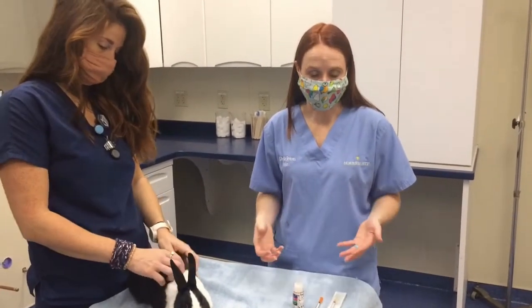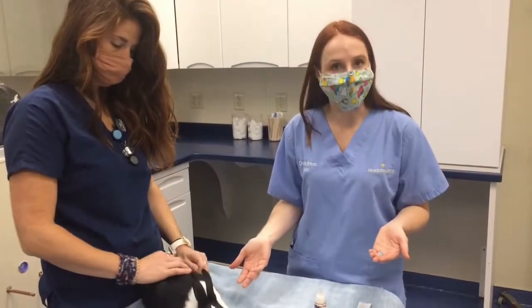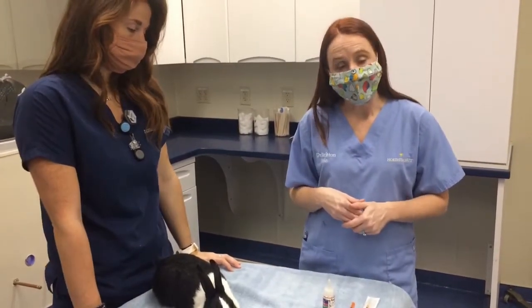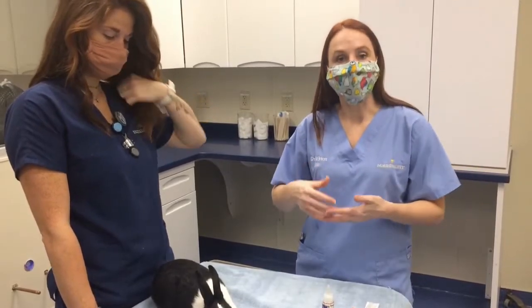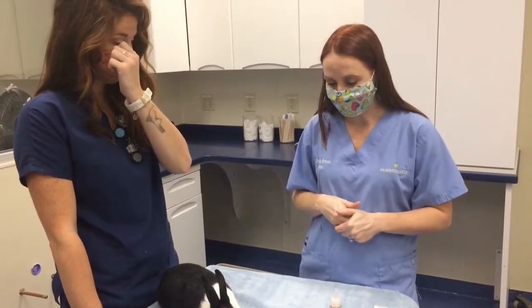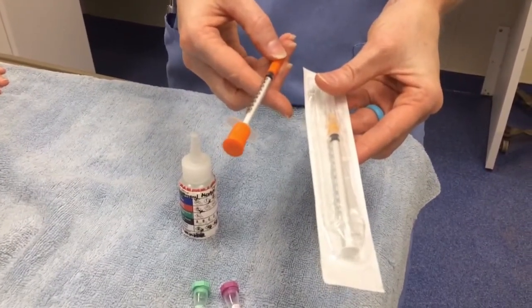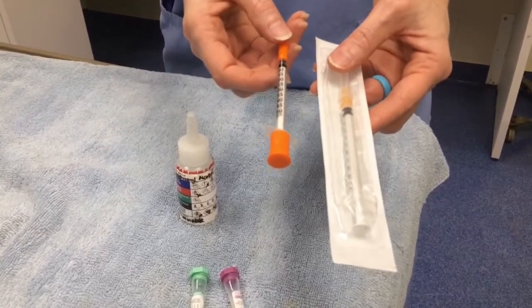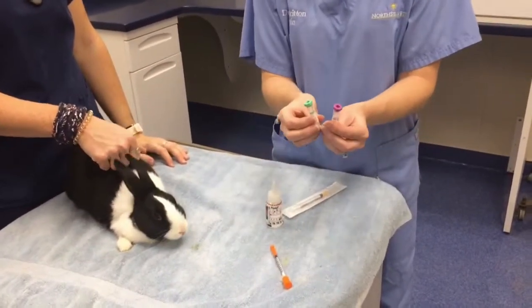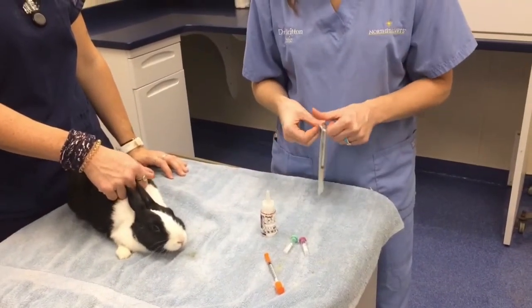Now we're going to demonstrate how to draw blood on a rabbit. Sometimes on overnights or during the day we need to get blood on certain animals, and a rabbit is a very common one. It is a little different than a dog or a cat — normally we're going for the lateral saphenous vein. We're going to demonstrate not only where that vessel is but also the hold, doing the in-the-air on-the-body hold. When drawing blood from that vessel, I usually use a 1 ml syringe with a 25 or 24 gauge needle, or an insulin syringe works as well. You also want to make sure you have some alcohol as well as a light green and a purple top tube, which are easy to run on the Abaxis in-house machines or as a send-out.